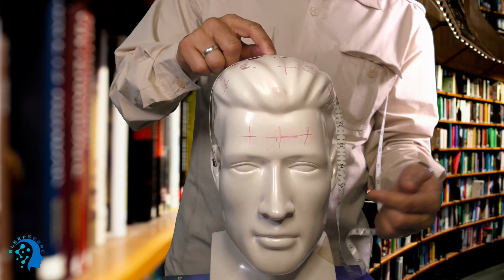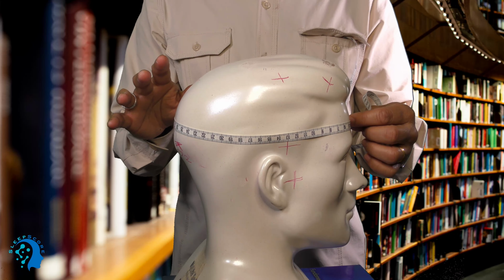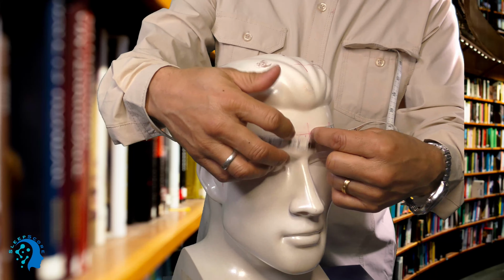Now the next thing I did is measure the circumference. I went like this, then I measured the half of the circumference, marked it, and went 5% and 5%. You have to make sure it's only 5%, because the total distance between these two points is supposed to be 10%. That's why from the center we went 5% on either side. The same way I went 5% either side over here too.